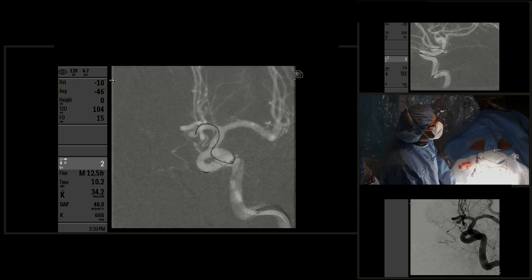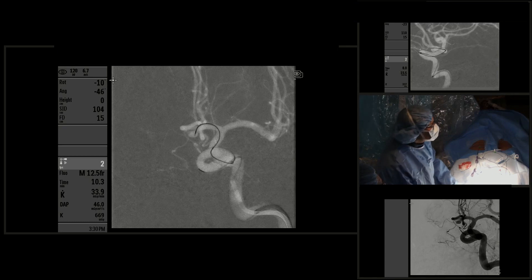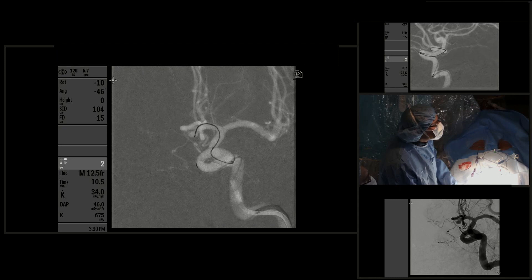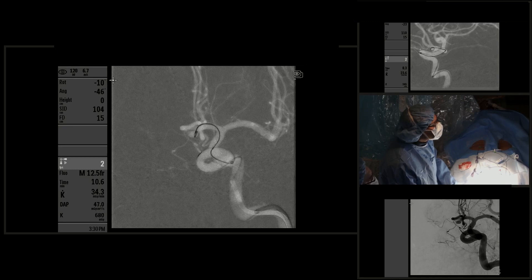After advancing the microcatheter into the aneurysm, we go ahead and start advancing the coil. The measurement of the aneurysm was 4.5 millimeters in maximum dimensions, so we decided to choose a 4 millimeter by 6 centimeter Target 360 soft coil. Again, we are advancing the coil very slowly to prevent perforation of the aneurysm.